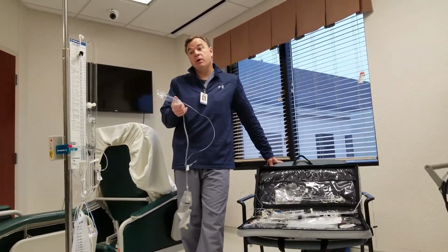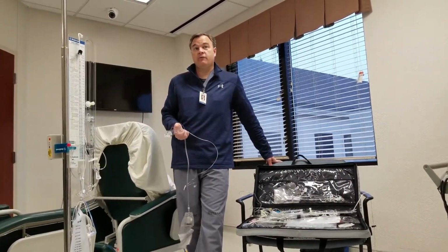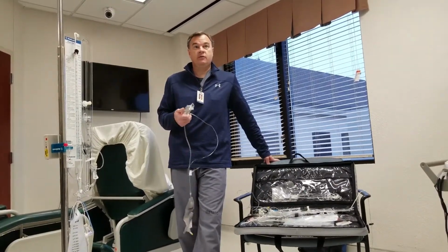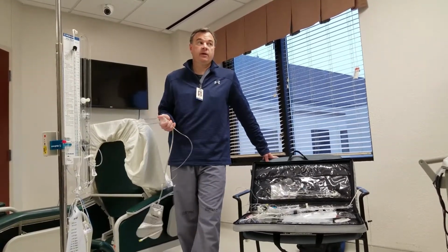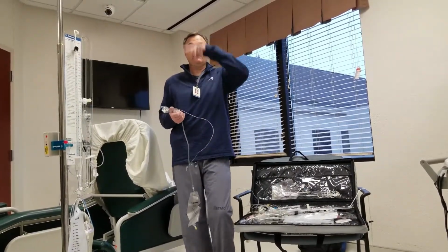If you want to manage pressure, you've got to use something like this. And that's kind of a surgeon preference thing, how they want to manage it. Is it something that you're just trying to relieve? Typically you'll see pressure more frequently if it's going to be a long-term thing, because taking volume creates big peaks and valleys.